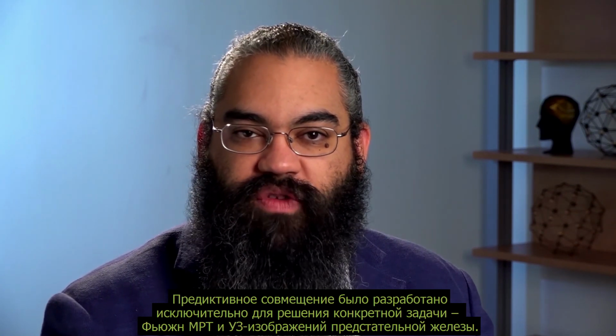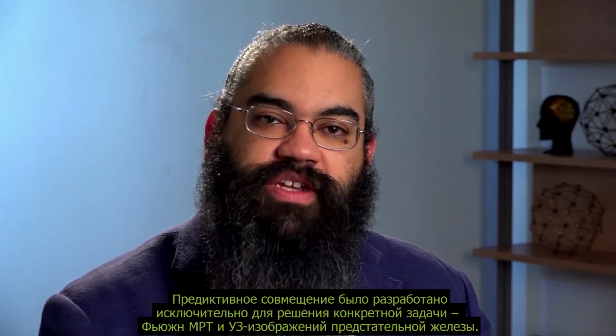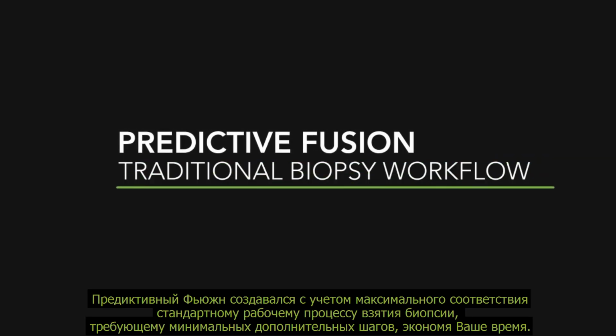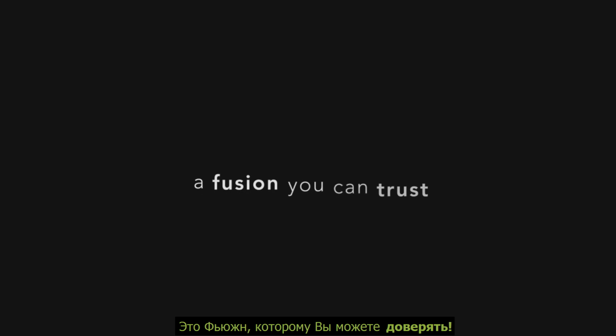Predictive Fusion, however, was uniquely developed for the specific task of fusing prostate MRI to ultrasound. Predictive Fusion was designed to closely fit your traditional biopsy workflow, requiring minimal extra steps and saving you time while providing a fusion you can trust.